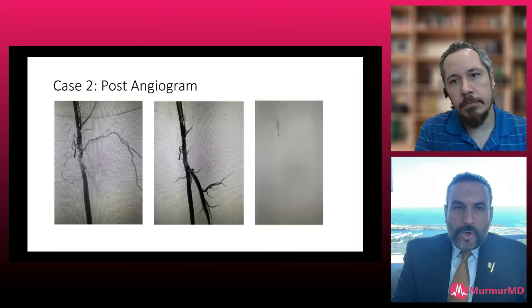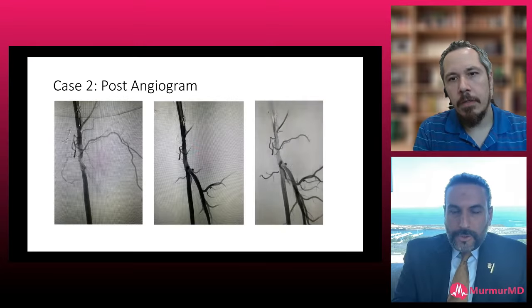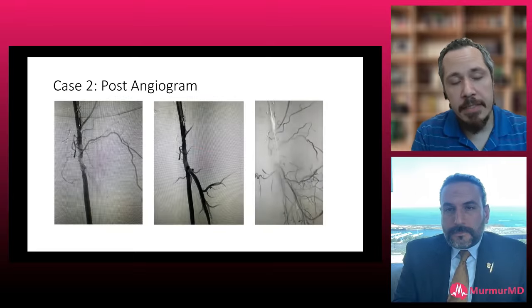Obviously, clearly, no need for stenting. Would you have considered stenting it up front? I think it's a little bit challenging. Now, you don't need to, of course, but sometimes with your initial picture, you start wondering whether or not you could get that type of result by leaving nothing behind. This is fabulous. Yeah, stenting is on the back end for us.